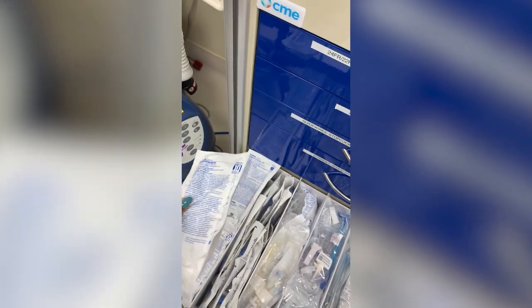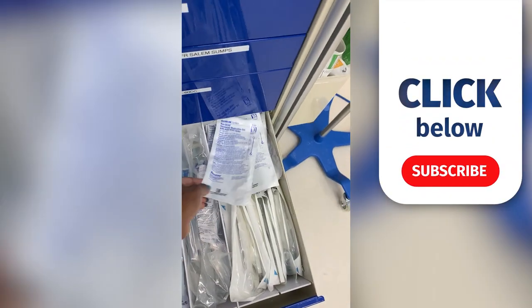We actually use IV tubes of many different types to connect them. This one we actually use for blood transfusions. You can see there's a little ball in there that has a purpose. Usually it helps us to know the fluid line. And there's a filter, so we can filter anything out of blood products, so that none of that enters the patient. Yeah, we have a lot of different types of IV tubing.